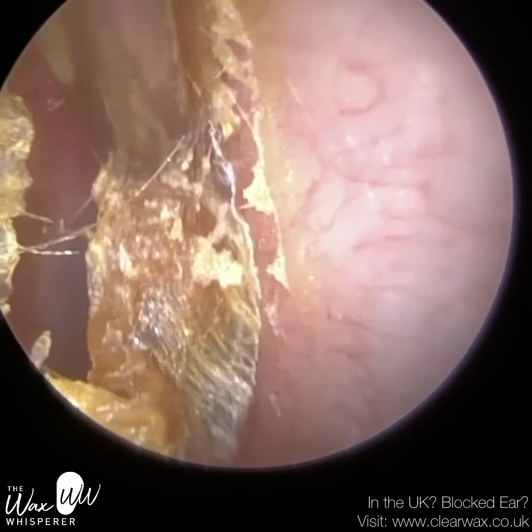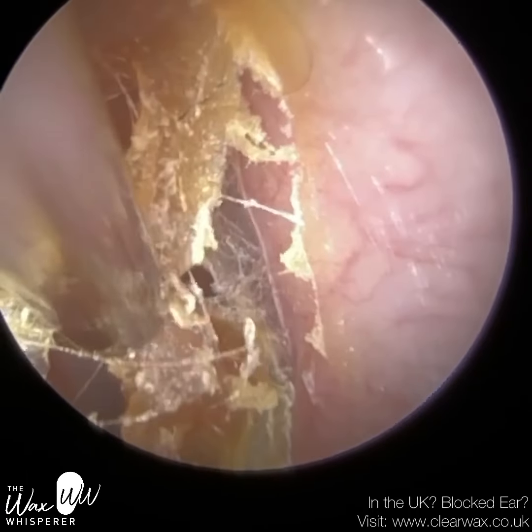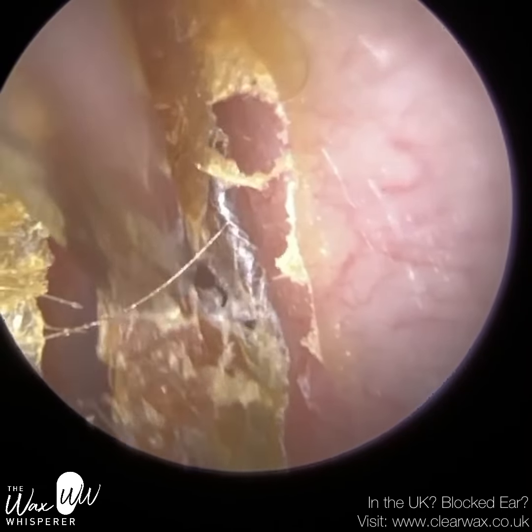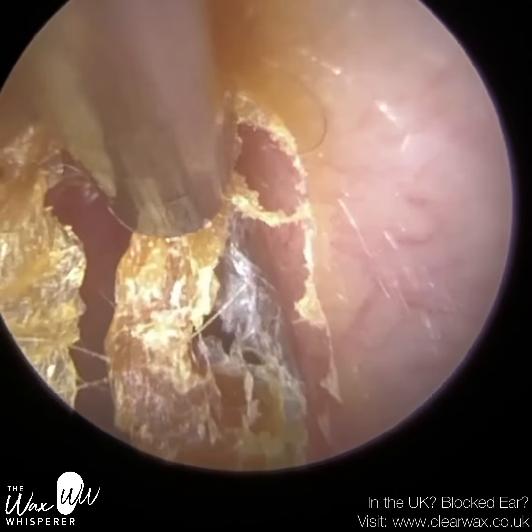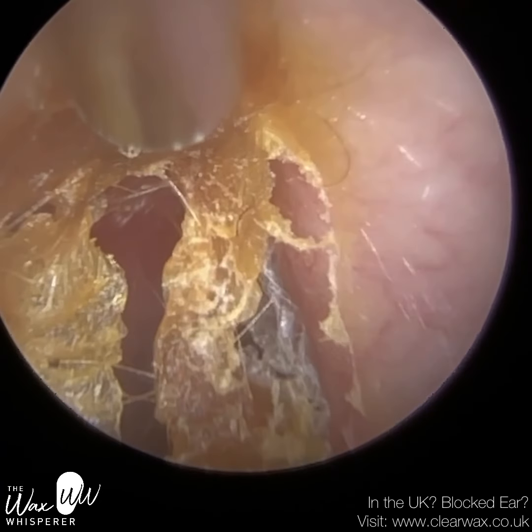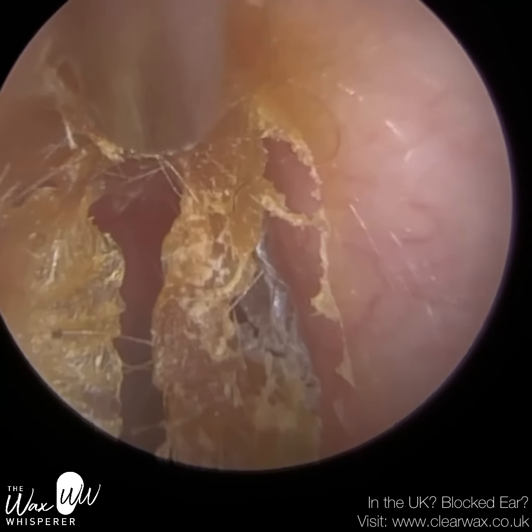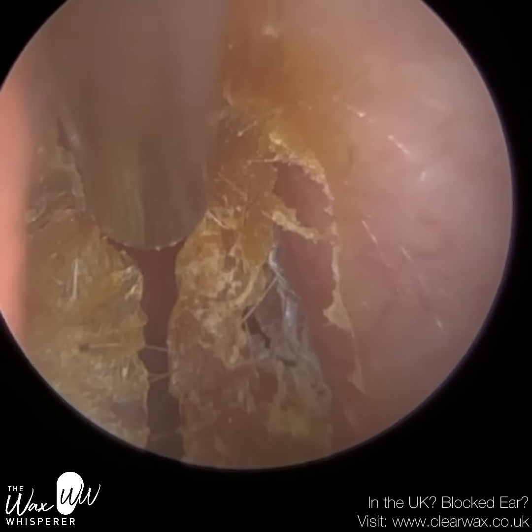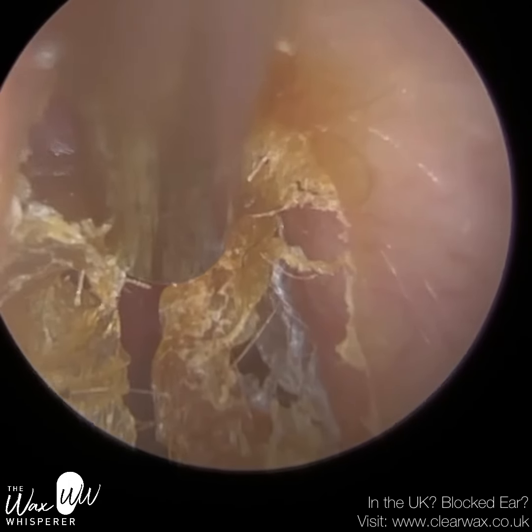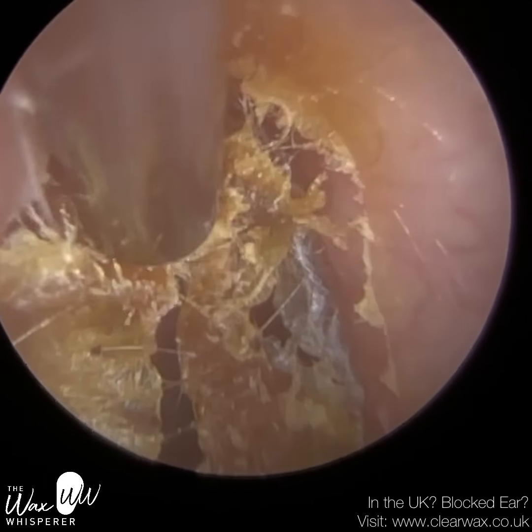With this skin it was a bit soft — I didn't need to use the drops here. So we're just peeling this away. It's dry but it's got a bit of moisture as well, so it's not embedded, it's not crystallized. I'm just gently peeling this away. I wanted to avoid the drops wherever possible just because the patient is a hearing aid wearer and they're going to leave the clinic wearing the hearing aid — I don't want their ear to be oily if avoidable. On the left side we had no choice, because it can just block up the hearing aid. So I've just gone to the roof of the ear canal and I'm just peeling this downwards. The skin is actually all the way on the eardrum.